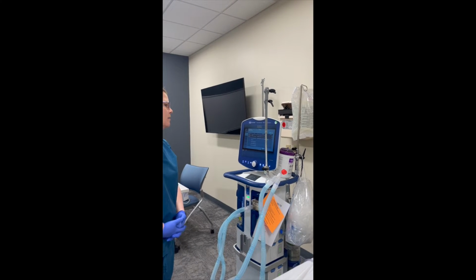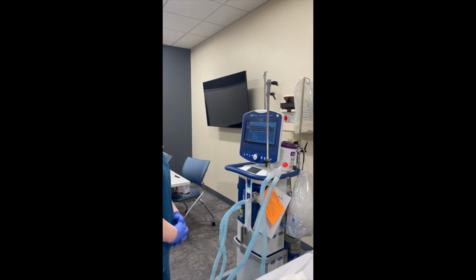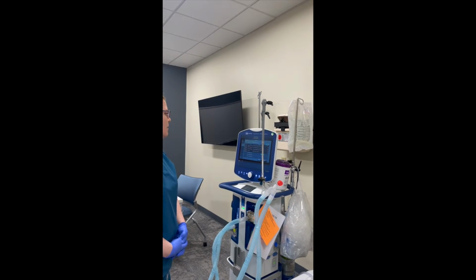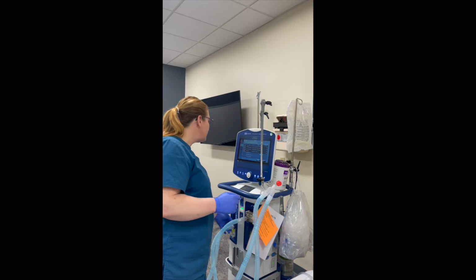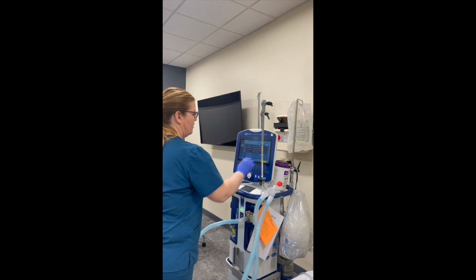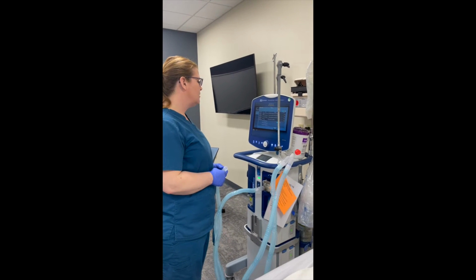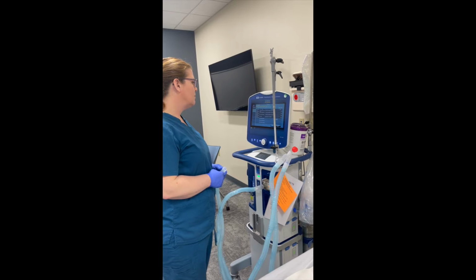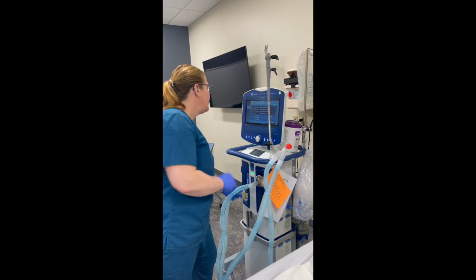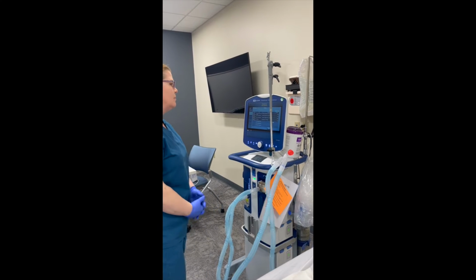That has passed. Okay, so we're gonna disconnect the circuit at the expiratory filter. And press accept. So we're gonna reconnect the circuit. Accept it.